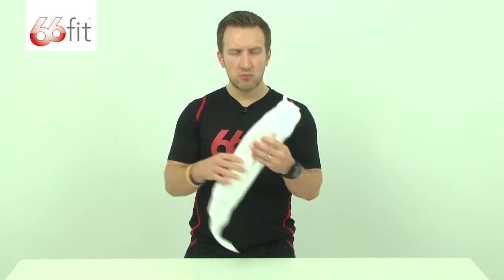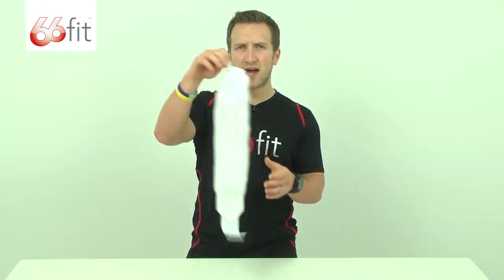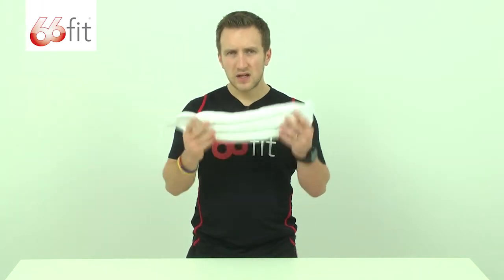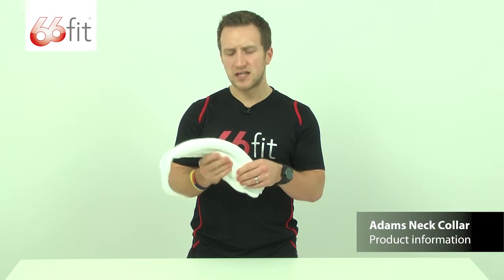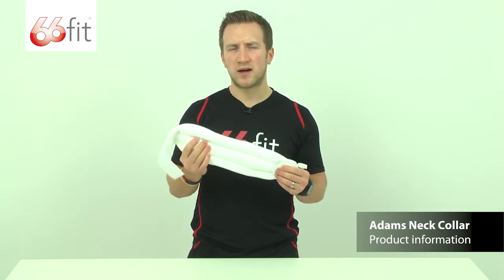The collar can be washed, but only hand washed. Once you've hand washed it, make sure you hang it up to dry and leave it out to air. This collar is a fantastic collar due to its lightweight nature and the moldable polystyrene beads inside, and that's what makes it one of the most successful and popular collars on the market.